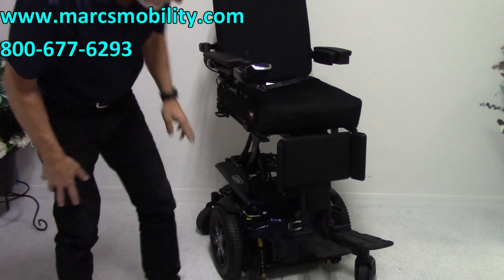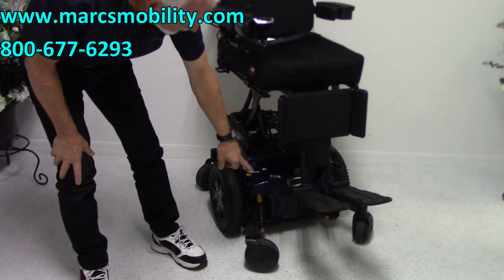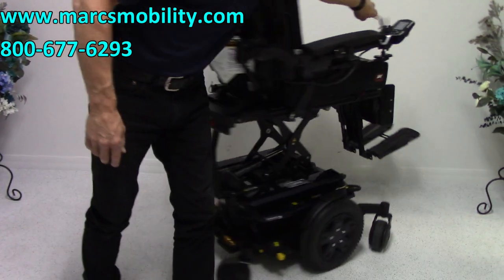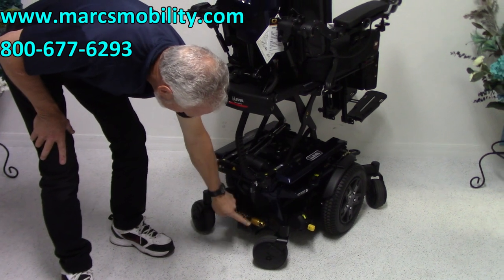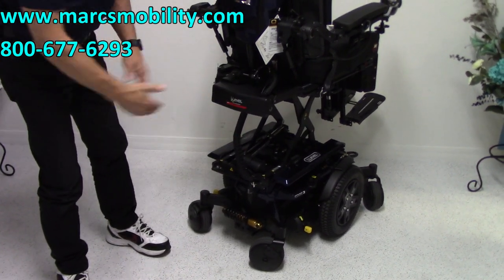The suspension on this chair — you've got a huge suspension in front on both sides. You can see the suspension there, and you have the same suspension in the back. You can adjust that suspension by turning this ring here to make it tighter or looser.